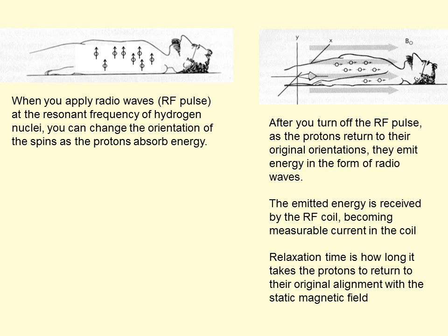Now the relaxation time is an important concept. That is how long it takes the protons to return to their original alignment with the static magnetic field after you terminate the RF pulse. And that's going to vary, as we will see, for different tissue types.